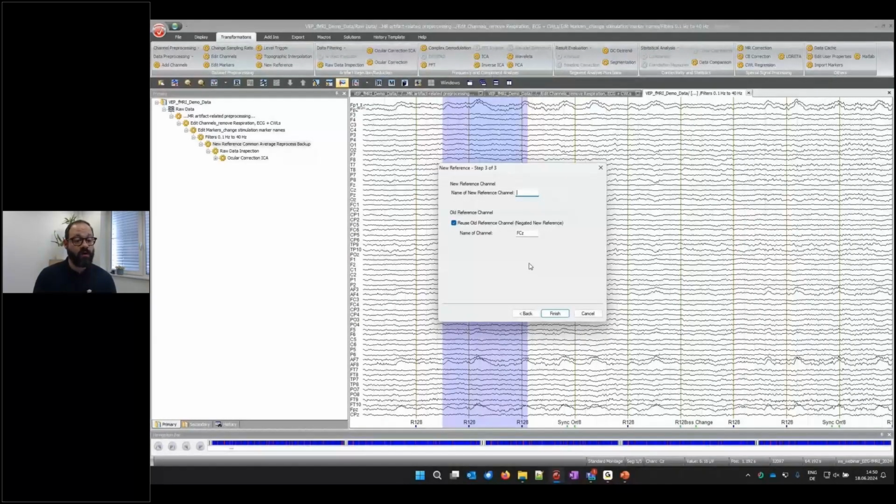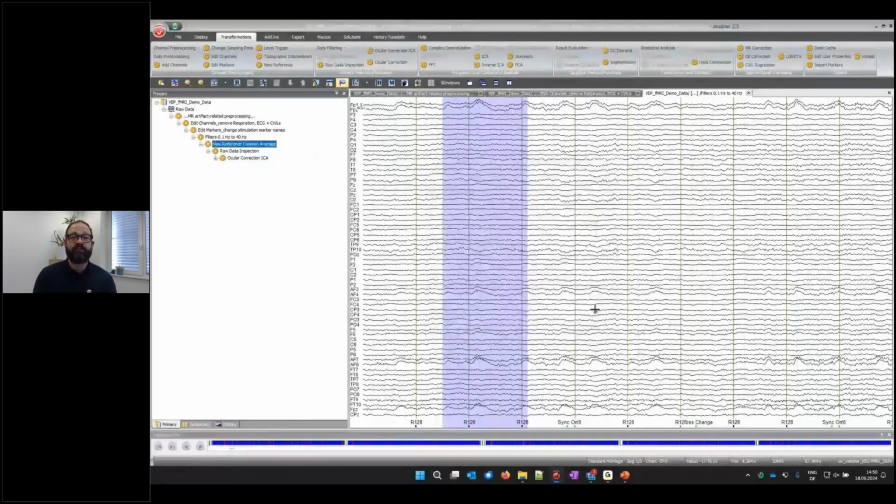Okay, so a common average reference is something that is very commonly used for ERPs, also for visual ERPs, it's fine. It has also another benefit when especially doing this recording in the scanner. So generally, you should avoid including some bias into your reference, which is why you usually use electrodes on the midline or the mean of the mastoid, so to avoid hemispherical bias.